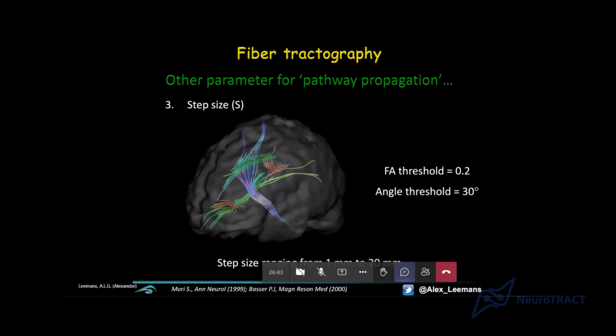If my brain is in the scanner, my brain has an infinitely dense sampling of locations. Every part of my brain is a location. But when we acquire data, we only acquire at discrete locations, because we can't acquire at an infinite resolution. We do what we call sampling. We sample signals at locations. And at all the other locations, what is the signal there? Well, we don't know, but we can make a very good, well-educated guess by looking at the neighbors.